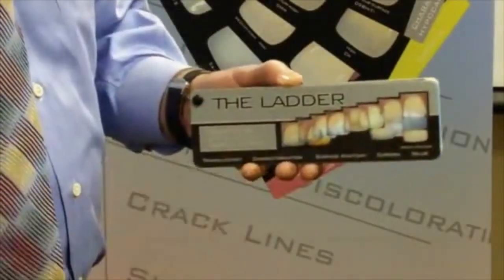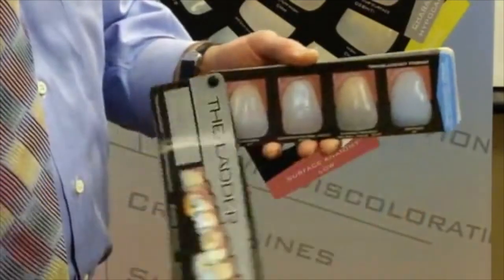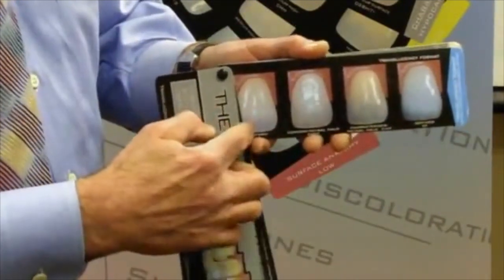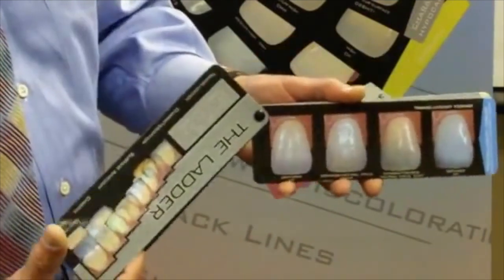First, I begin with the translucency format, which is found on several pages. These are the most common formats. This uniform is the most common, perhaps 60 to 70% of the patients.